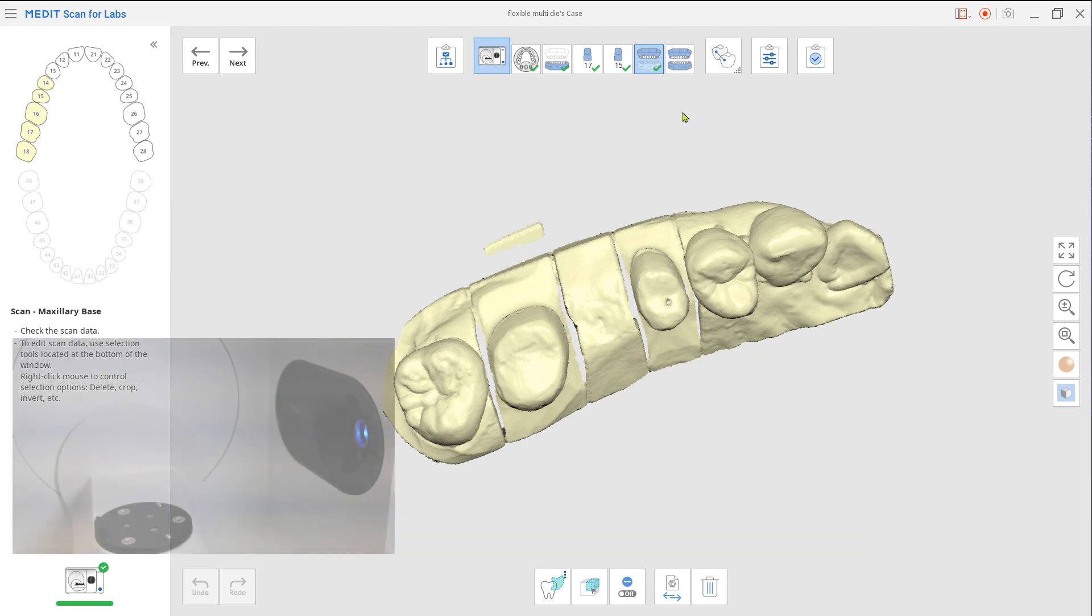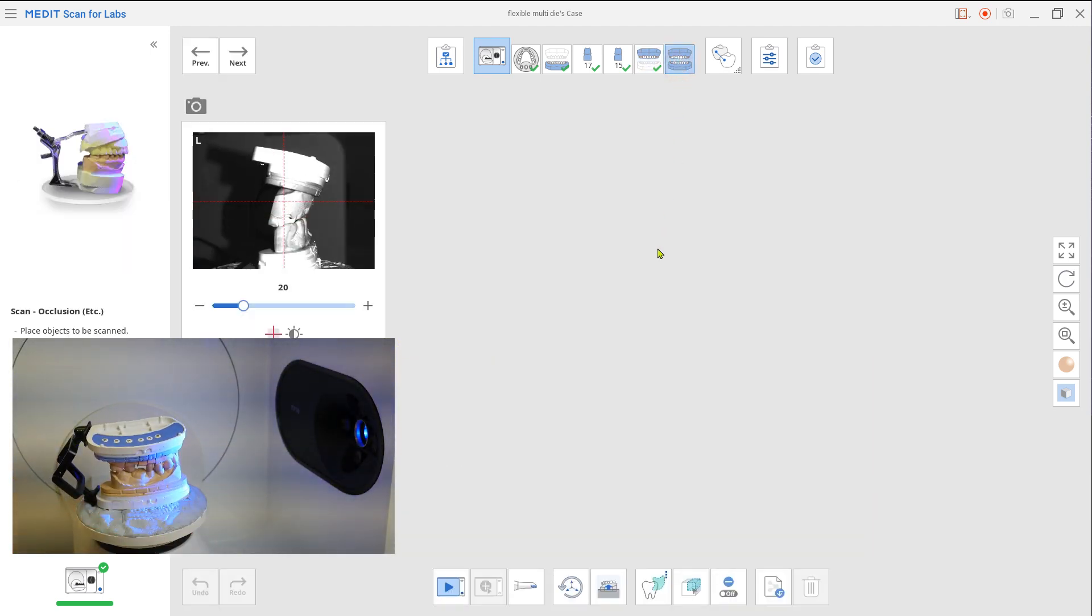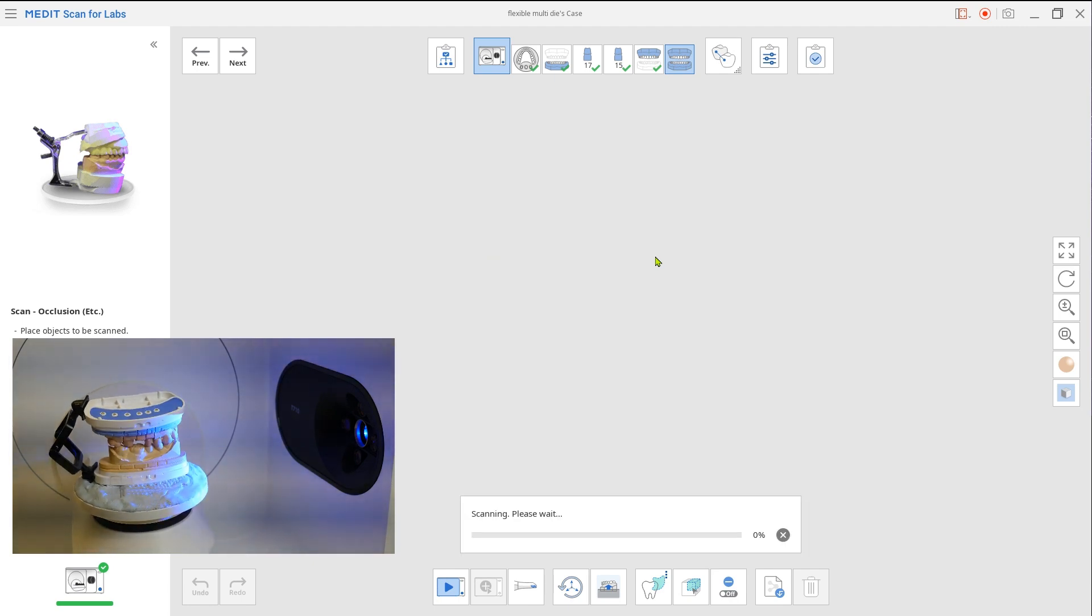You have both scanned and assigned upper and lower data. Move on to the occlusion scan.